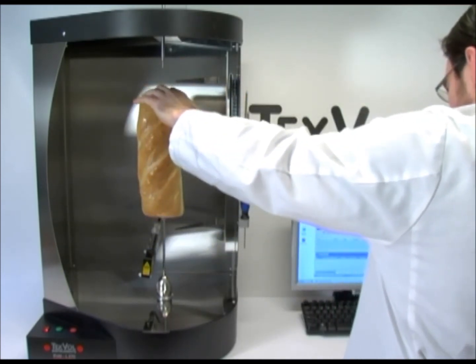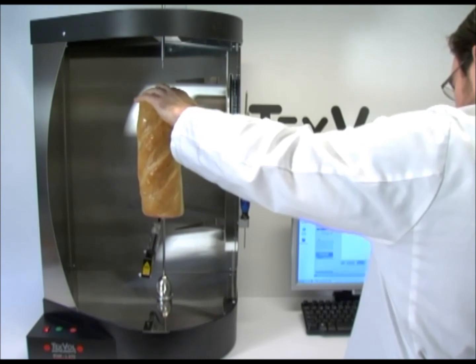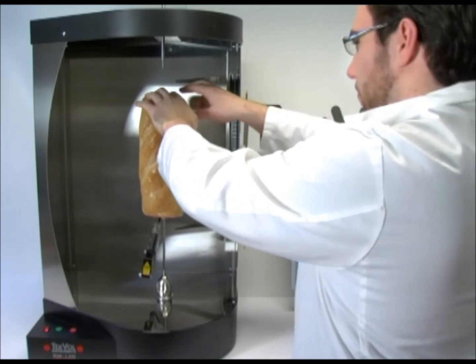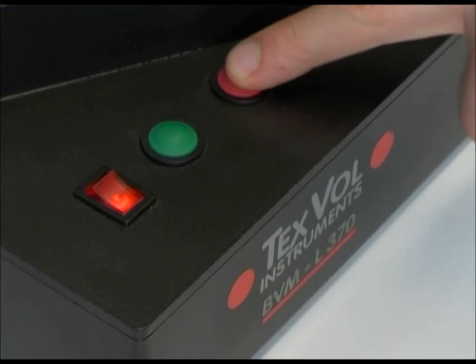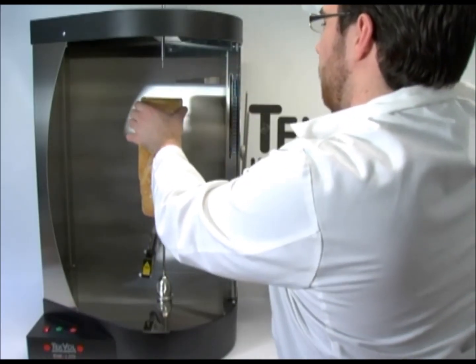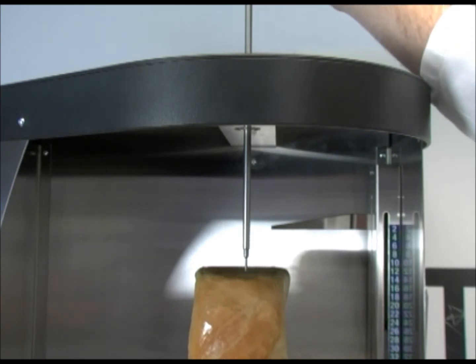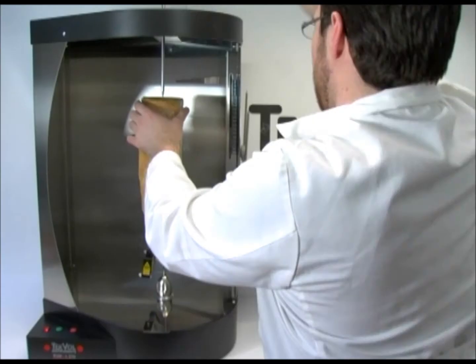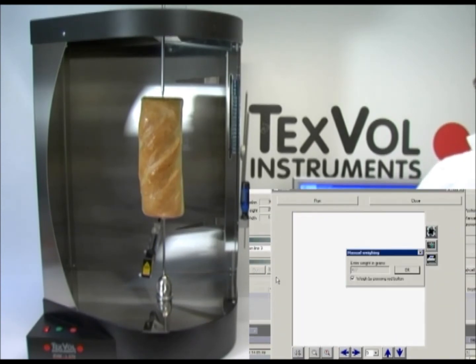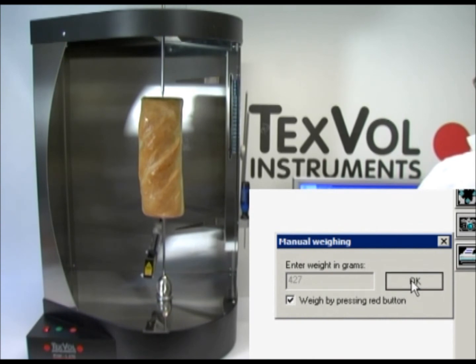If it is necessary to use the top support shaft in order to hold the object in a steady position, it is also necessary to manually weigh the object, and this should be done before lowering the top support shaft. By pressing the red button, the weight is registered. Then lower the top support shaft, making sure the product is secure and in a vertical position. Click on Run and click OK to start the test.